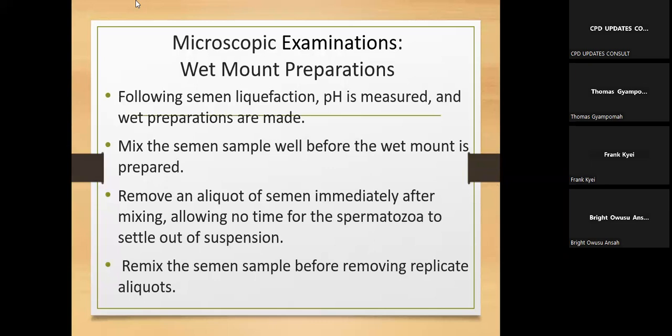So when the sample has been delivered, the first thing to do is your volume measurement. And for the volume, I've said that I strongly recommend the use of the weight method, where you take the weight of the empty container, you take the weight after the sample has been delivered, and then the difference is equivalent to, if the difference is 1.7 grams, the 1.7 grams is equivalent to 1.7 mL. I think we discussed that extensively yesterday. All right, so that's the first thing.